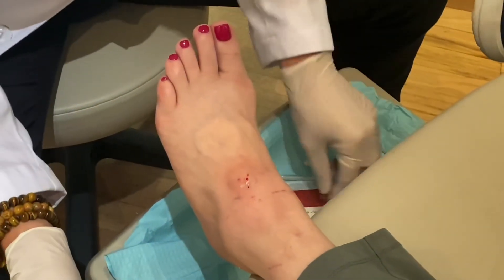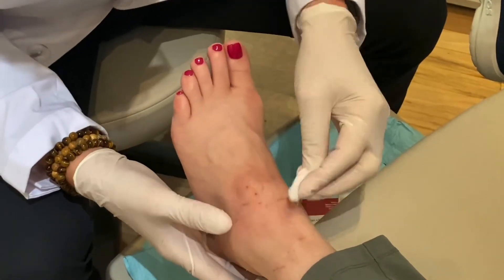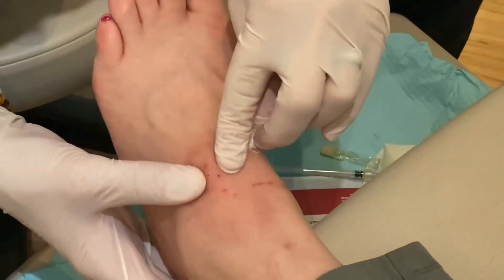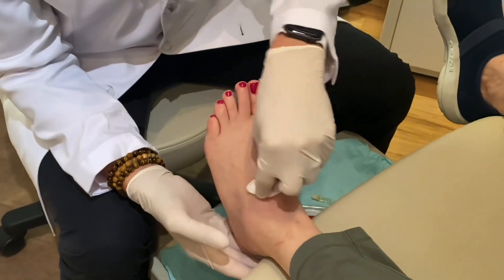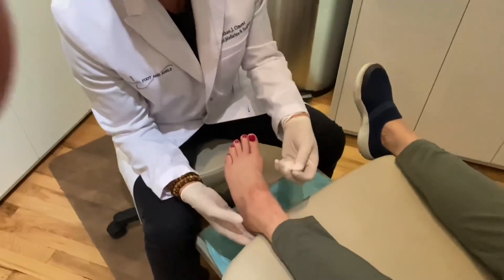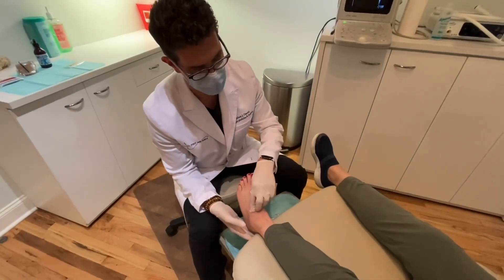And hopefully this takes care of it. The sad part of it is that this does make the area look like it's a big inflamed cyst again, but it's not — it's an empty sac that got refilled with some really good medication. Hopefully this is the end. We'll just put a pressure dressing on it and you'll be good to go.